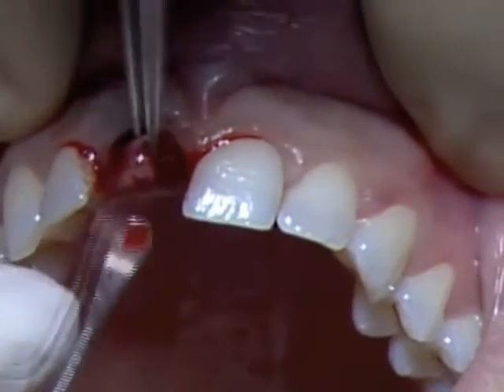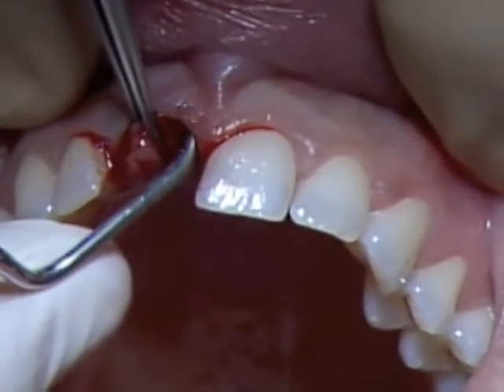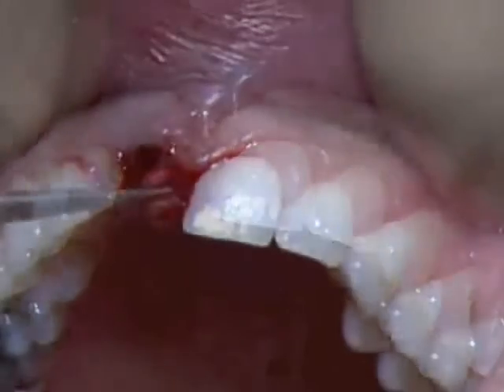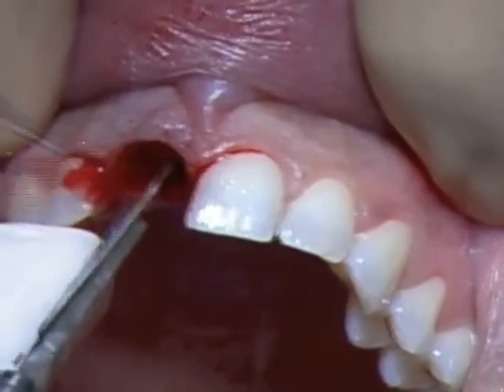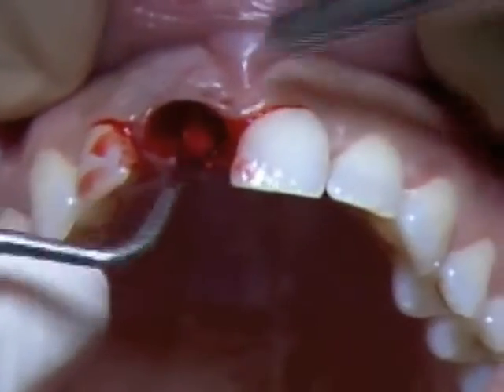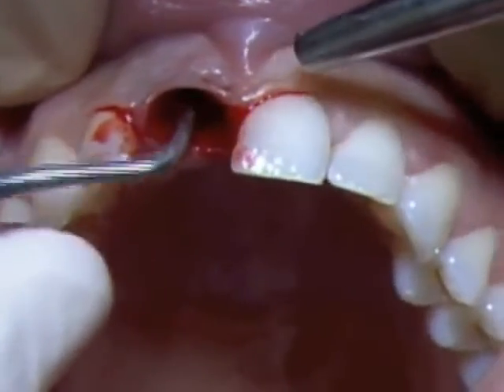And after we mobilized it enough, we will use our blade in order to remove it from the base. We then again use our curettes in order to make sure that our extraction socket is thoroughly clean and we remove any cyst remainings.